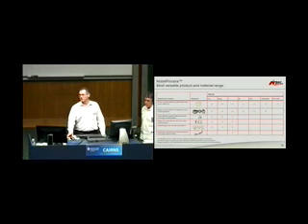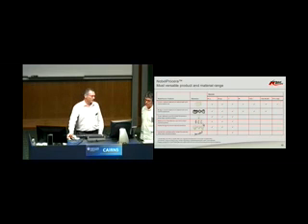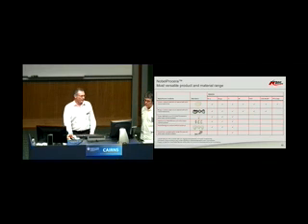In that direct fixture, it means that the layering, the veneering material, ceramic, composite, whatever it is, is veneered directly to the abutment, so it's a single tooth direct fixture. Customised abutments for cement-on crowns or transverse screw-retained crowns, if that's what you prefer. And bridges for direct ceramic layering. And overdenture bars, virtual designed overdenture bars.